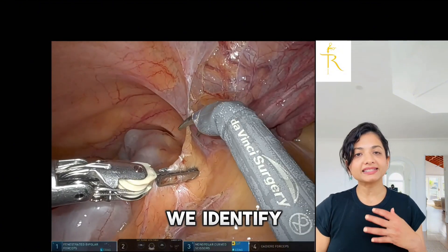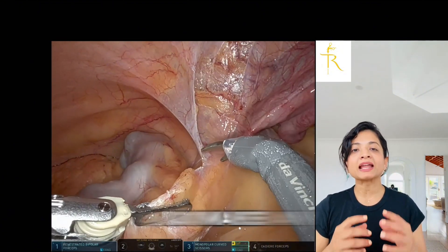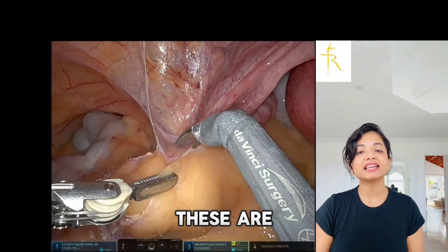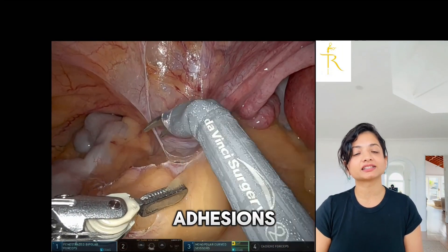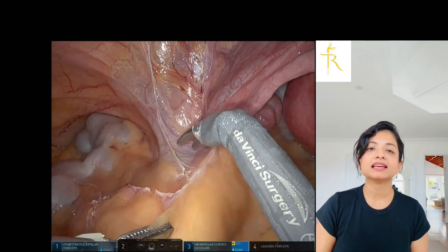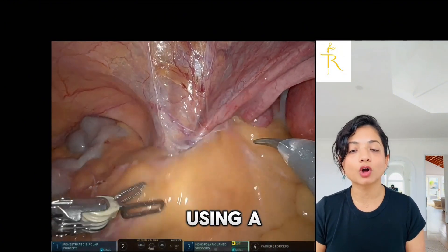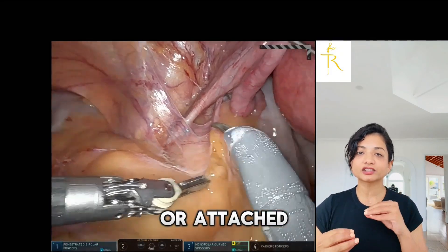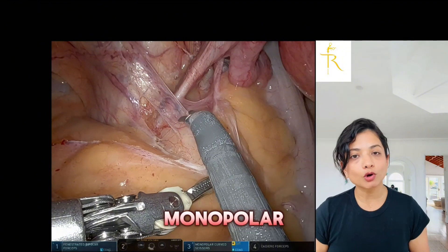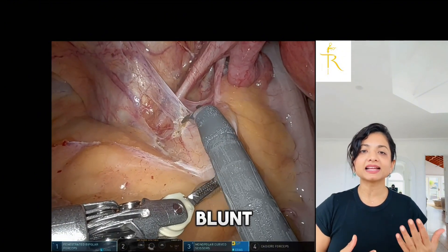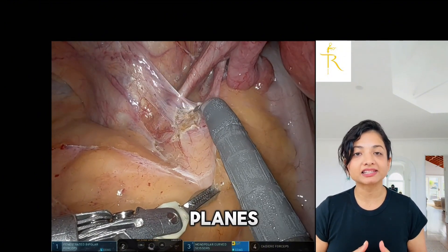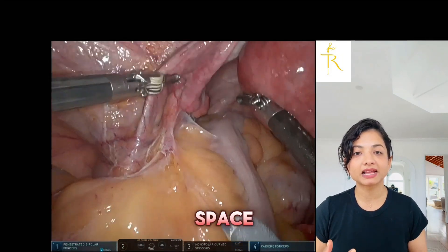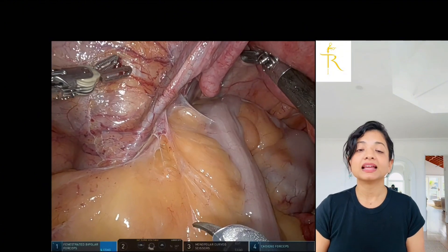We identify the mesocolon attachment and make an initial peritoneal incision near the line of Toldt. These are congenital adhesions and often have variations. This is done using a combination of sharp dissection with scissors or energy, and you can also use monopolar energy. Blunt dissection can be used at times to create planes between the sigmoid mesocolon and the retroperitoneal space.